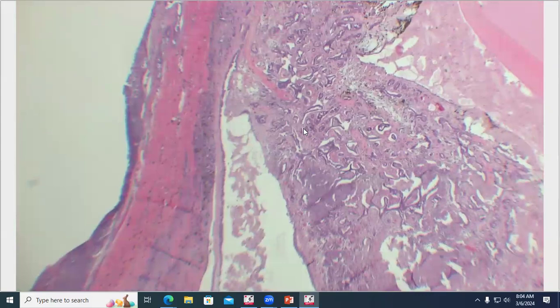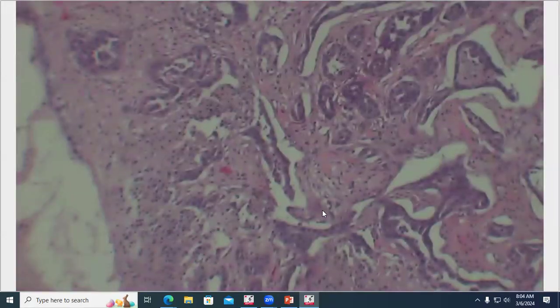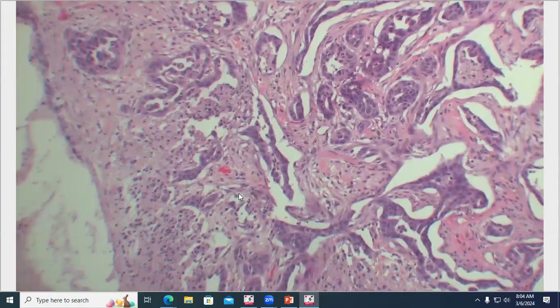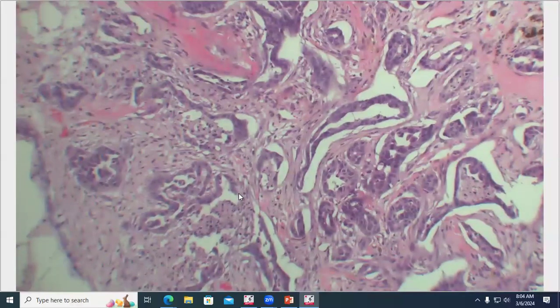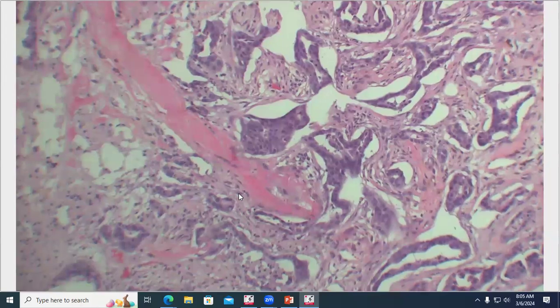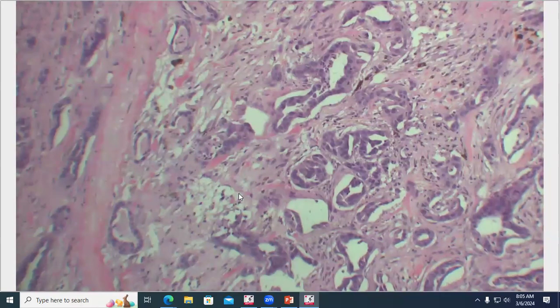So when we look at the iris stroma, we have similar looking cells that are forming cystic structures and lining them in the iris stroma. One might argue that some of these are lining the lumens of blood vessels. Sometimes it's a little hard to really hang your hat on that confidently. But they are forming these sort of epithelial structures, if we can at least say that. And let's go higher.